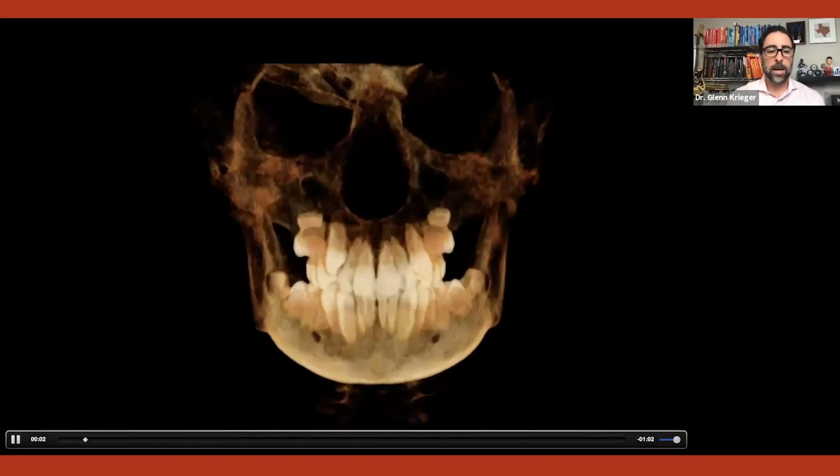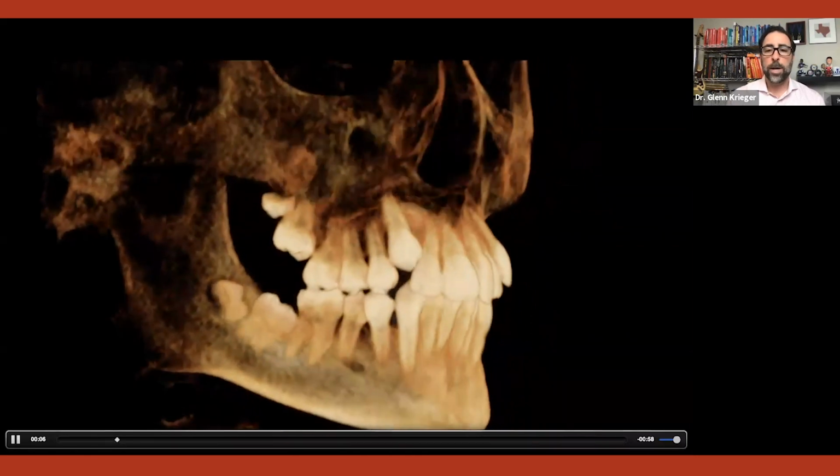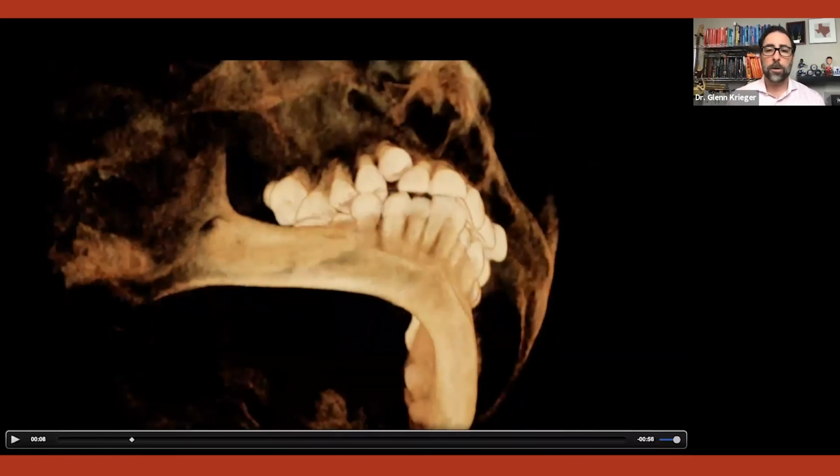Let's go back to this and let's look and see, where is that cuspid really relative to the arch space that I have? How nice is that for me to be able to look at that? Now we know we're short on space, but how much are we short on space? Because there are formulas we can figure out in terms of proclination of teeth, in terms of expansion of teeth, in terms of distalization.